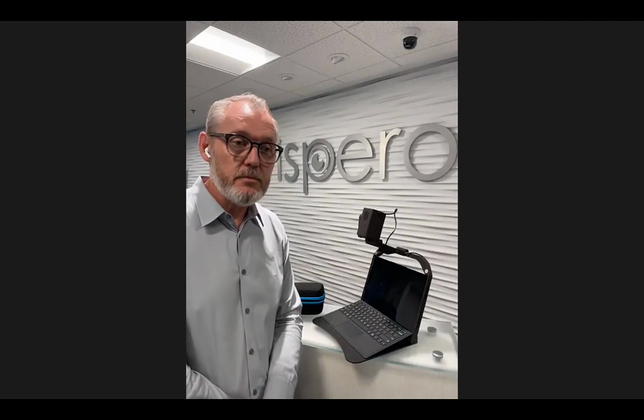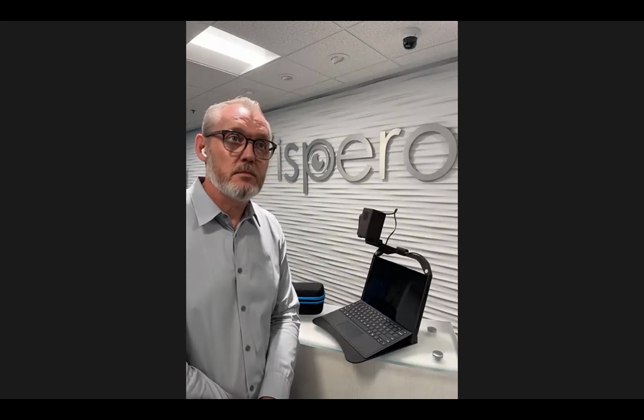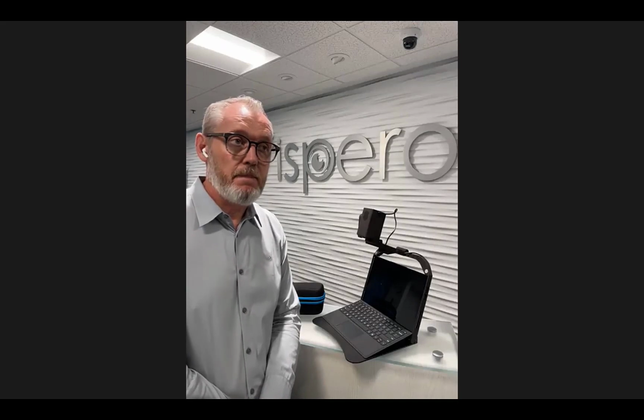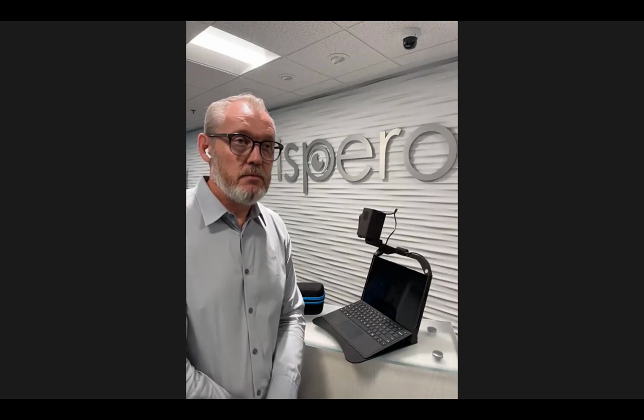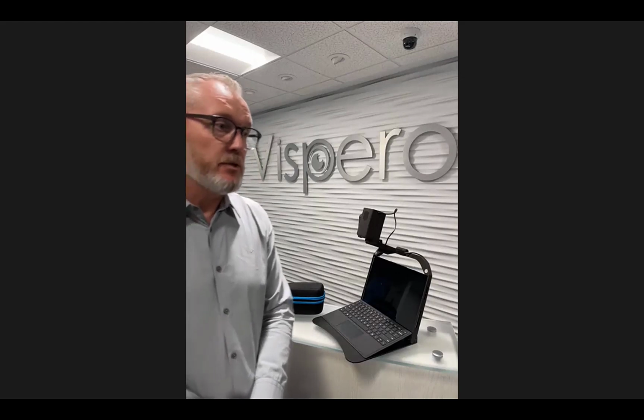So we had a question from Julie Akers: does it allow a user to capture a form and fill it out and send it back to the instructor, etc.? I'm assuming you mean capture an OCR, or take a snapshot and then fill it out, and that would be no. It would capture the document and save it into a dedicated folder. From there, you could access it, edit it, and then send it on.